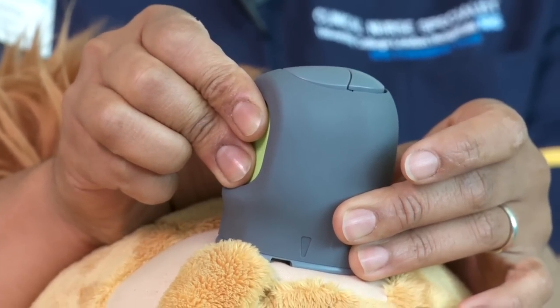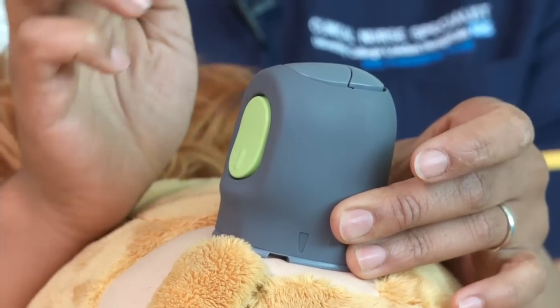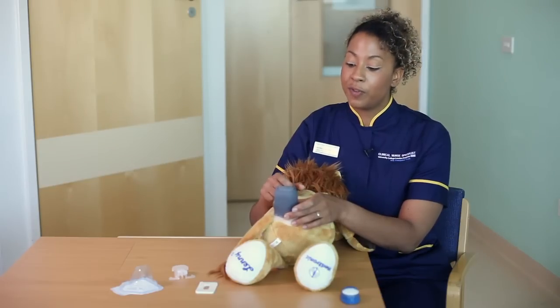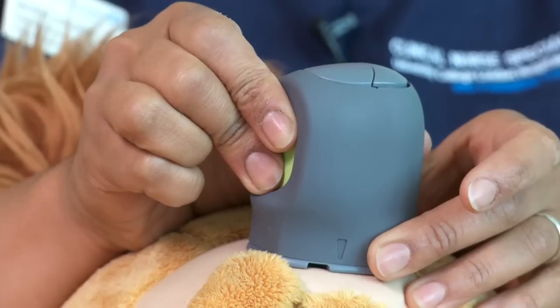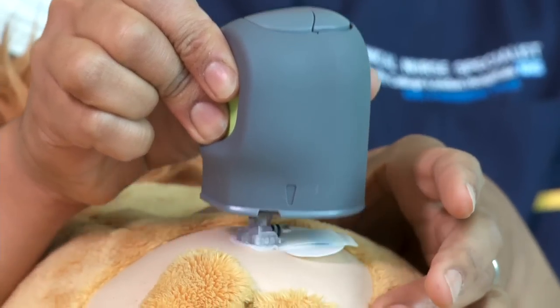Press and let go. It's the let go action that fires the sensor in and you'll feel that happen. To remove the insertion device, press and hold the button again — that opens up the insertion device — then pull away.